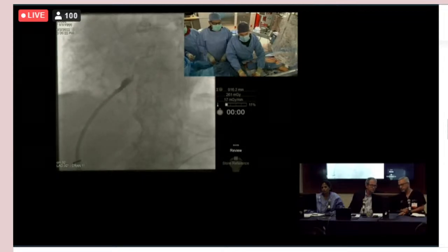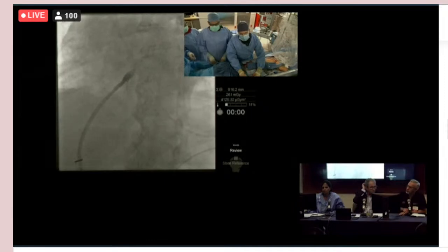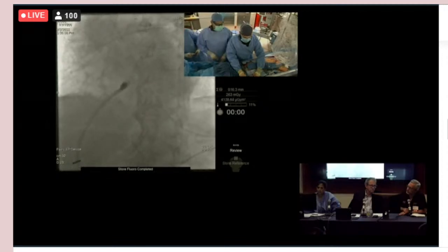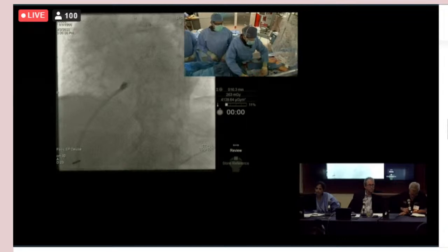And so you can see where it gets the septum right there. Yeah. So I feel pretty comfortable about that. The gooseneck looks okay. I'm just not a hard pusher kind of person. Okay. Well, we can certainly see how we do. It deploys. So I've unlocked the tether. And if John's okay, I'm going to see how we do with this.